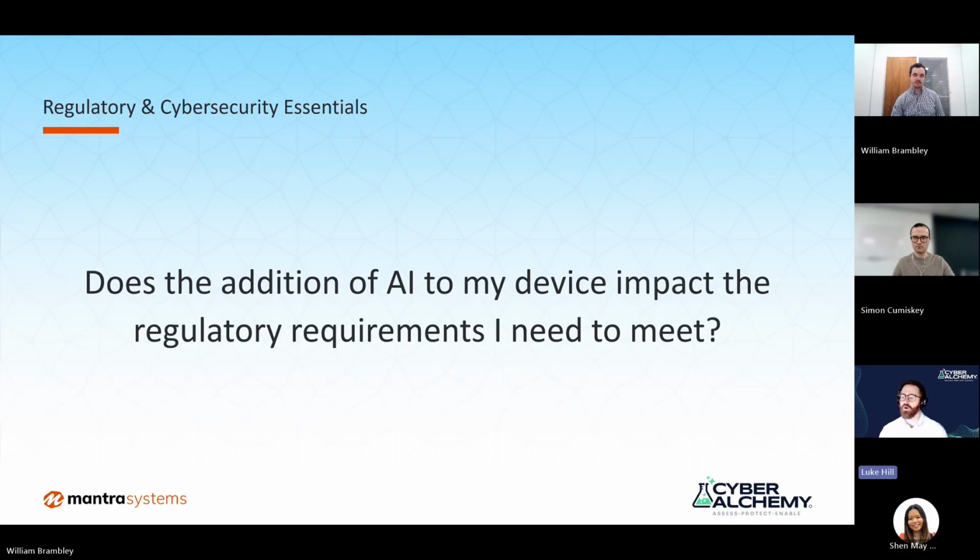So if you host it yourself, there's more burden on you to get the technology right. And if you were to look at an external provider, you're also kind of outsourcing some of that risk, but then you're also outsourcing the control. And what's right for your product is always going to be a bit of a debate, right?